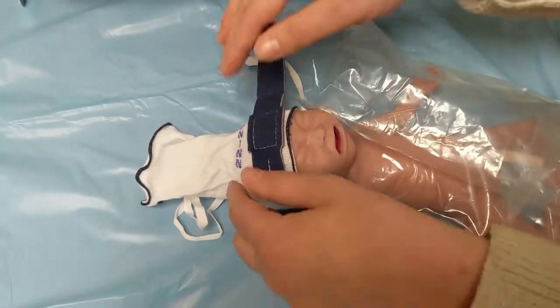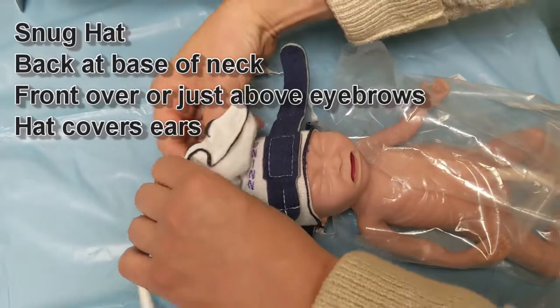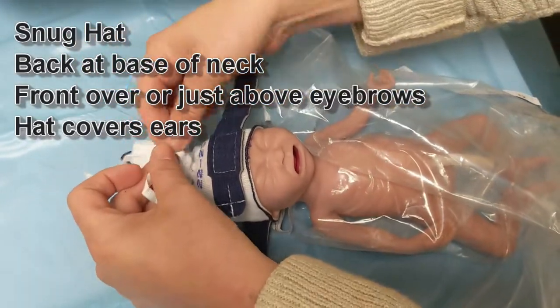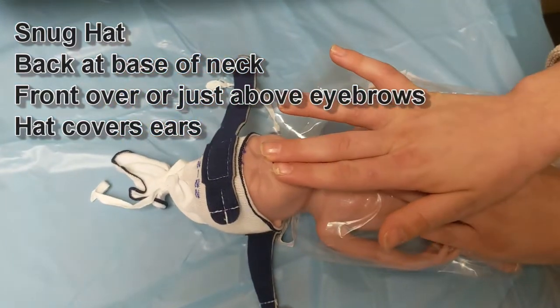These hats can stretch out quite a bit, and so you want to change them probably every two to three days. Because when they do stretch out, they can pull up, and that will pull your whole inner face up and pull your prongs.